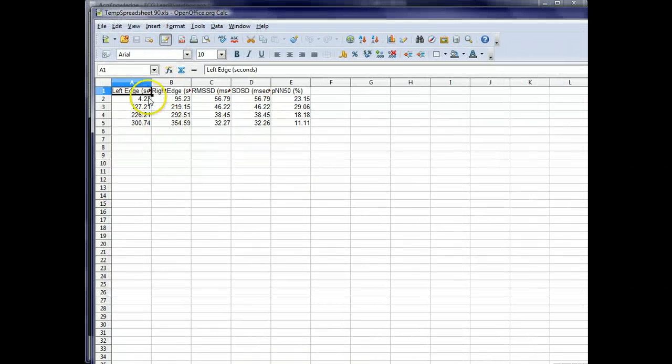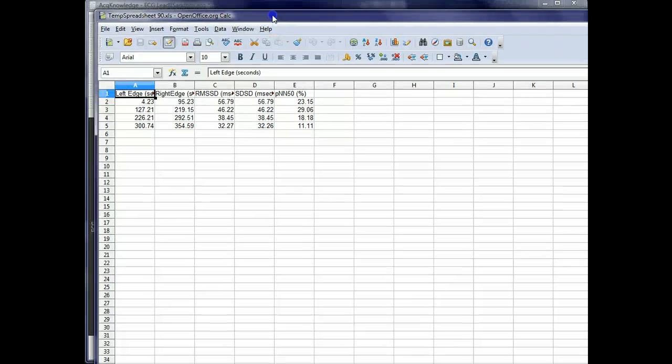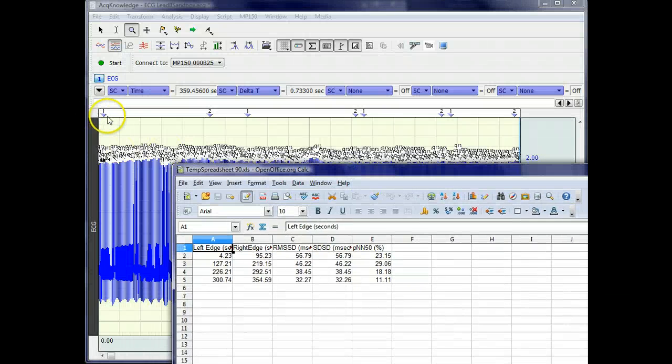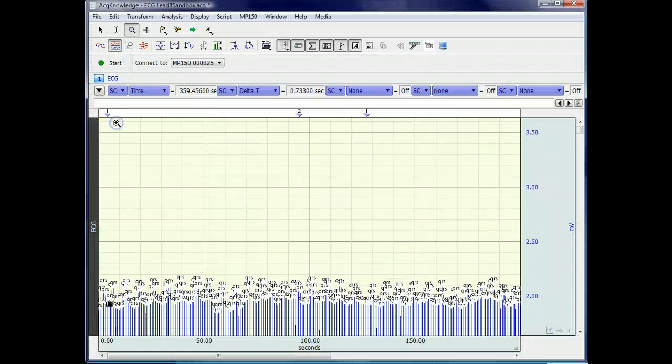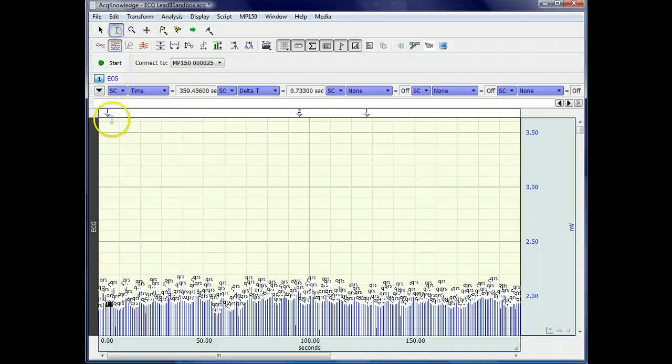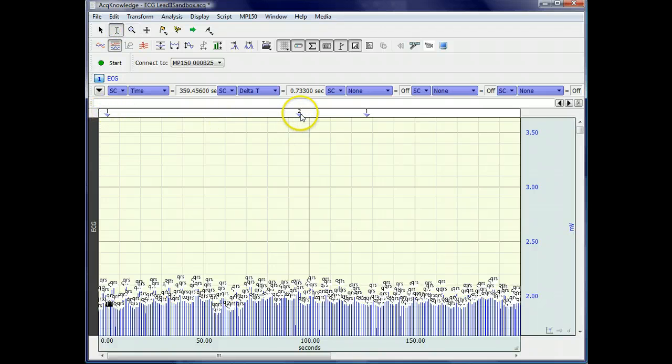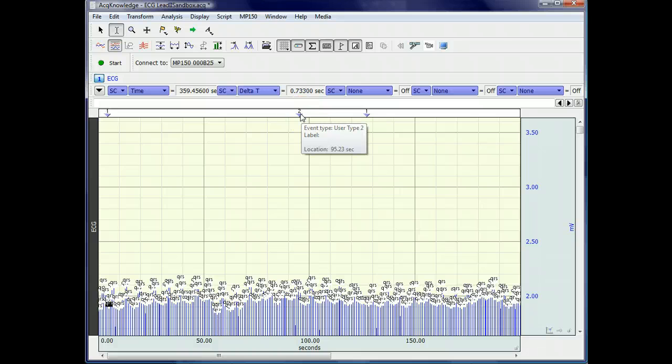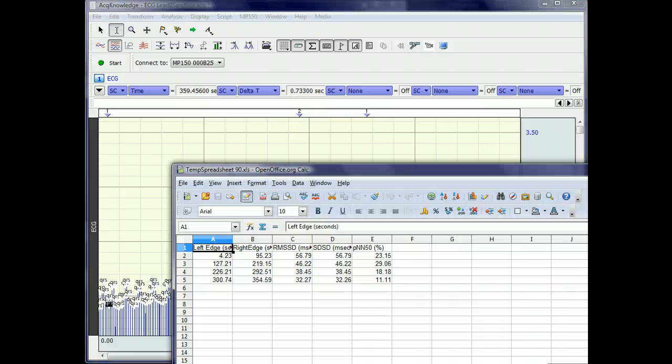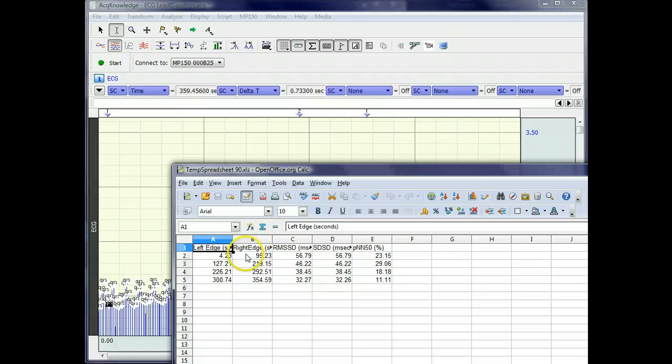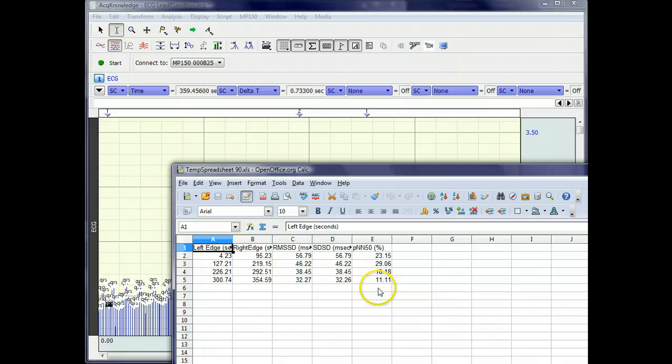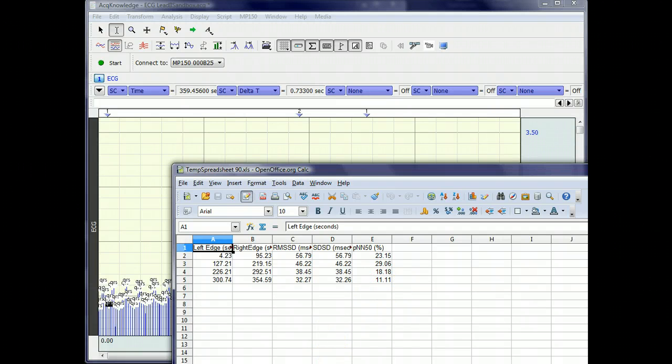So here's the right and left edges of the first segment. You see this starts at 4.23 seconds and ends at 95.23 seconds. These are the time periods indicated here. And then the RMSSD, SDSD, and PNN50. Thank you.